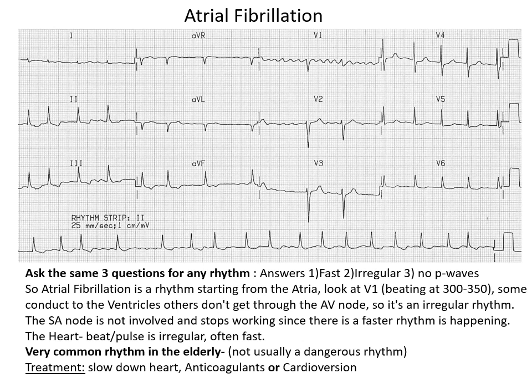So basically what's happening is the atria are fibrillating, okay, and they're creating some electrical signals that end up at the AV node. And the AV node is allowing some of the signals to go through to create a QRS, but at an irregular rhythm.